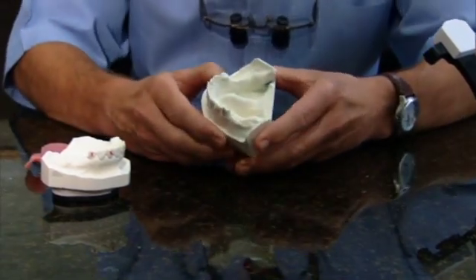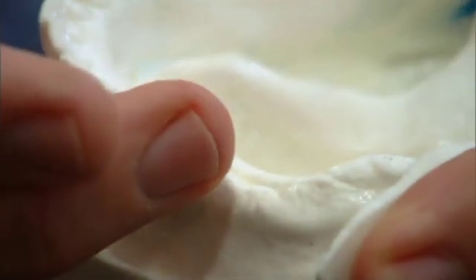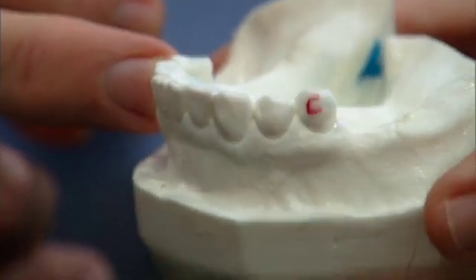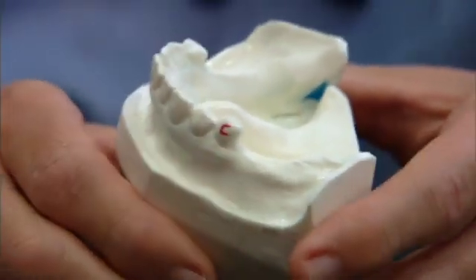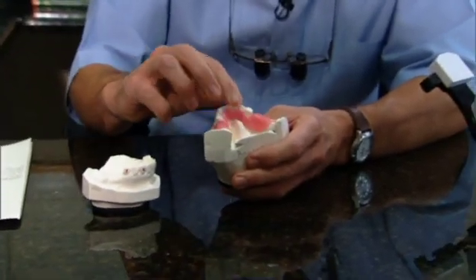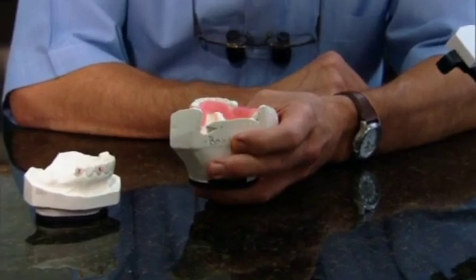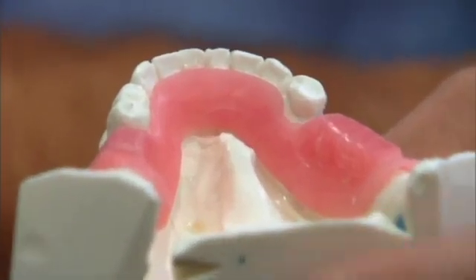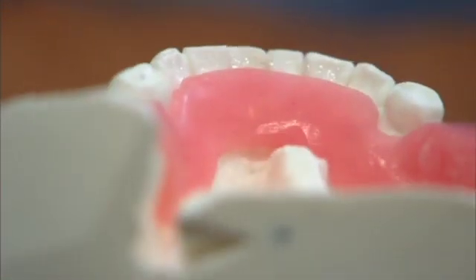On the lower, this is the situation she's in down there. We'll place a single crown on tooth number 20 and tooth number 28, and those will serve as precision attachments for a lower Kennedy Class 1 bilateral distal extension partial. We have mounted this case with a transfer base, and we will use this transfer base in our records. One of the things that I'd like for you to get from this video is called the Applegate technique, in which we will do a modified transfer base to make our final impressions for our removable partial.